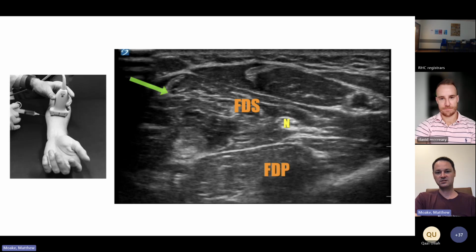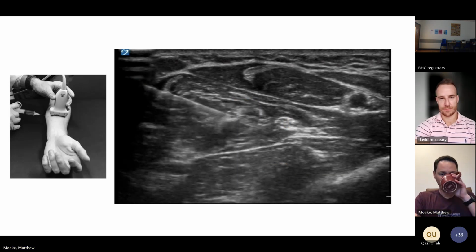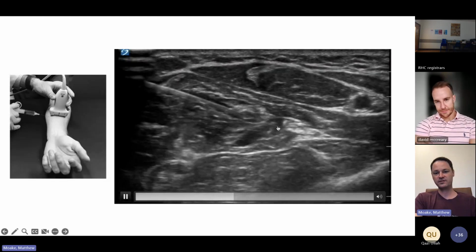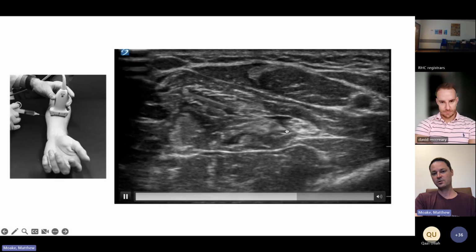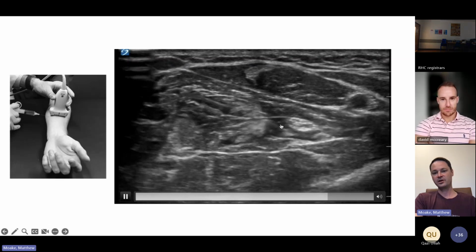So we've got those muscles again, needle coming in. Guiding it just past, right now we're right at the nerve itself, starting to deposit anesthetic. You can see that hypoechoic collection working around the nerve. Provider here is getting pretty close. You don't probably have to be that close, honestly. And then eventually they're going to work their way past that. And you can see that anesthetic, once you get under it, really guides around the nerve.